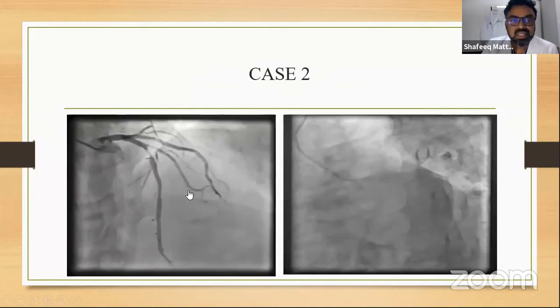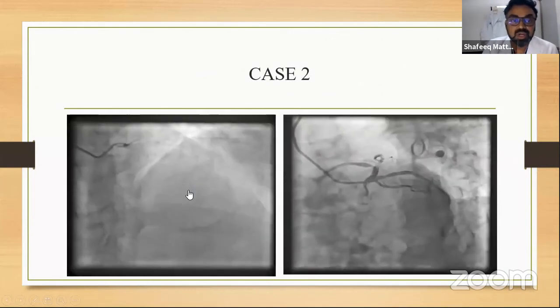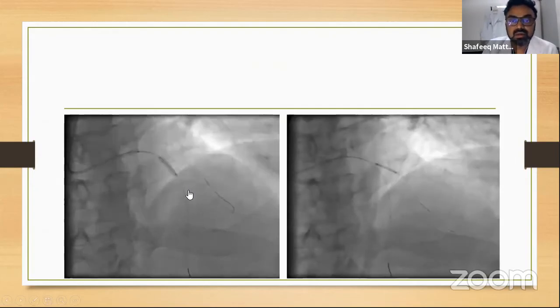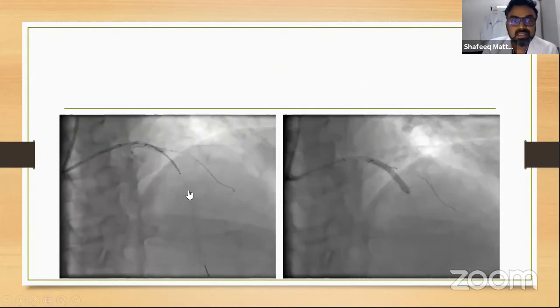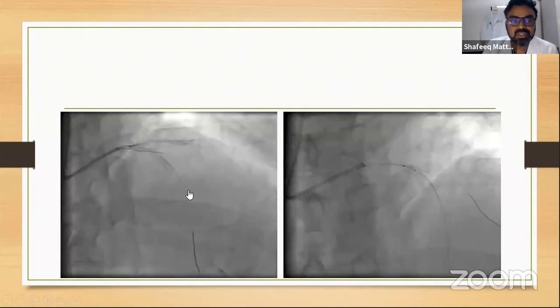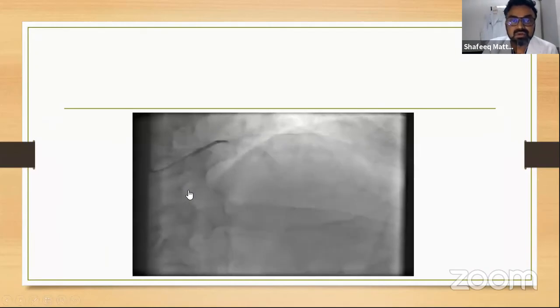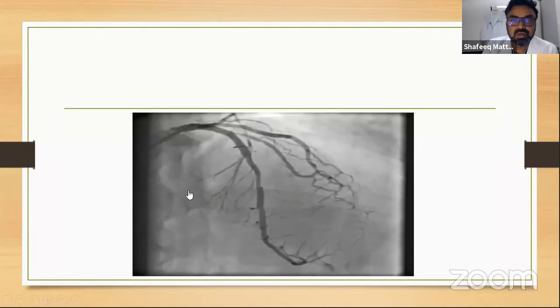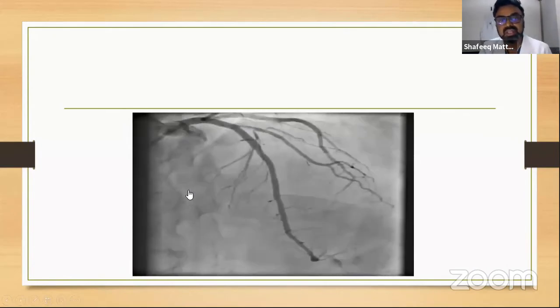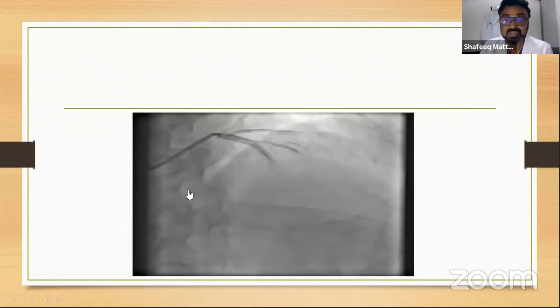This was another case. LAD diagonal, here there is some proximal plaque, and the plaque burden is high. So we did similar steps, and after the main branch deployment, recrossed. But here again, we got away without a kissing balloon. There was some persistent plaque there, but we did not go aggressively here because of the plaque burden, which might cause dissection and convert it to a two-stent strategy.